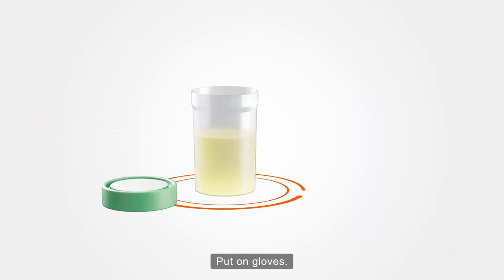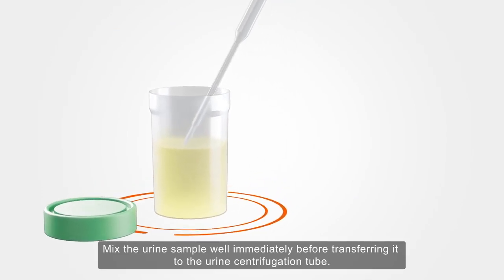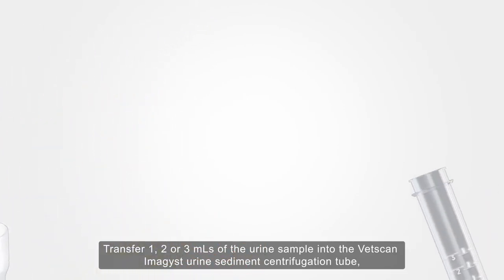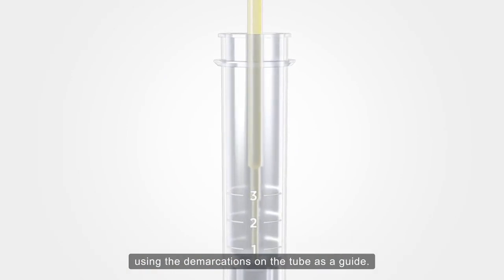Put on gloves. Mix the urine sample well immediately before transferring it to the urine centrifugation tube. Transfer one, two, or three millilitres of the urine sample into the VetScan Imagist urine sediment centrifugation tube, using the demarcations on the tube as a guide.